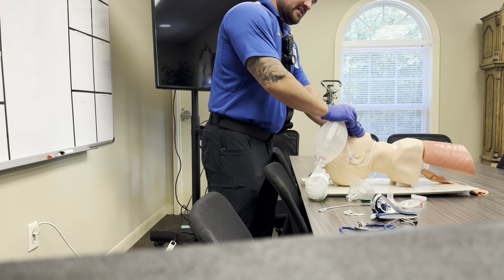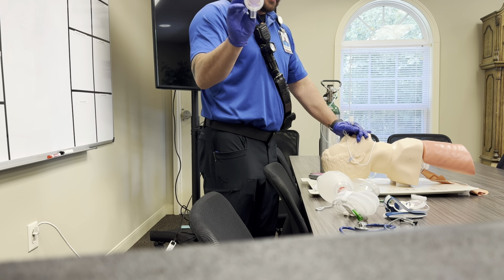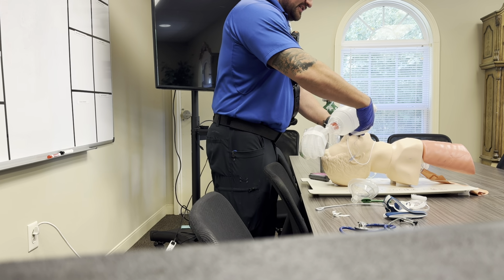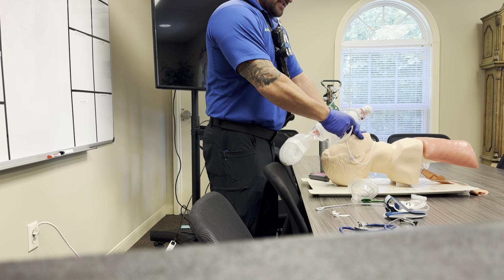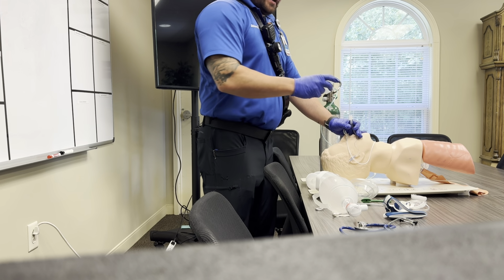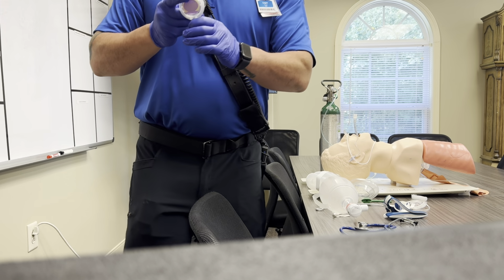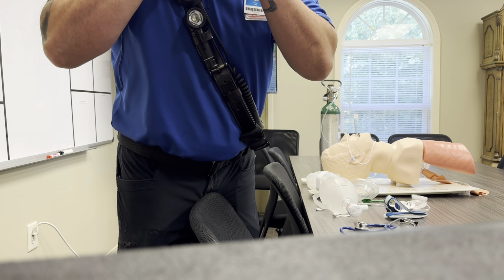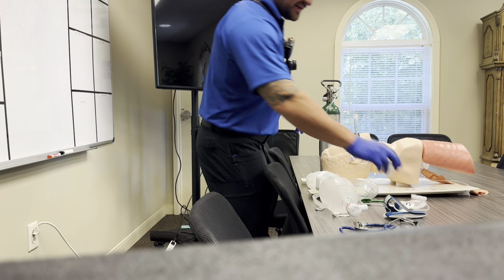Now, we require at my service a few different ways to verify, like I was saying. First being your colorimetric CO2 detector. Now, obviously, this is an airway mannequin, so it's not going to change colors. I'll show you on camera though what it does look like when it changes colors when you have a real human patient. So it starts out purple, you blow into it or exhale carbon dioxide, and it turns a nice yellow color. You know that you're in the appropriate spot.